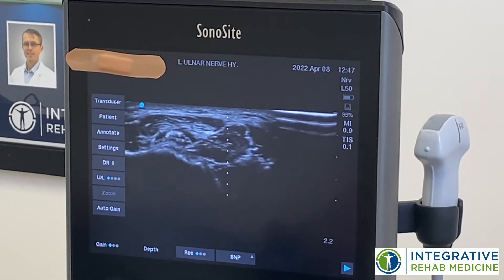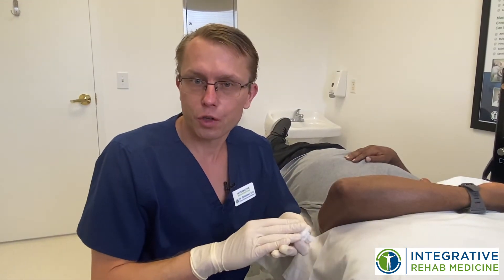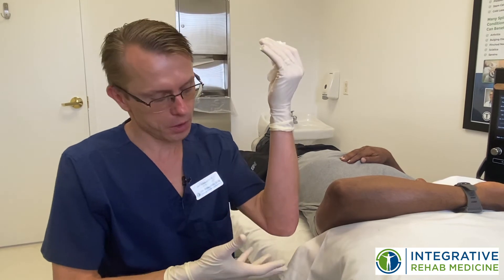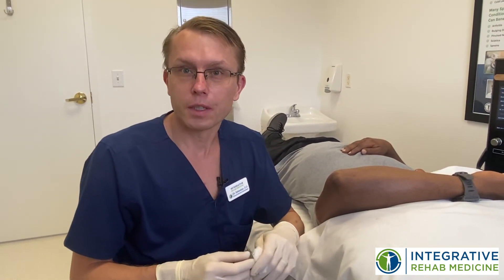Now it's really opening up. I've decompressed that ulnar nerve at the elbow, and hopefully that's going to allow him to decrease his symptoms. It's going to allow his nerve to recover and bring back some normal function. So we'll see how he does.